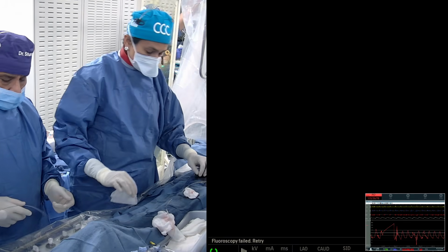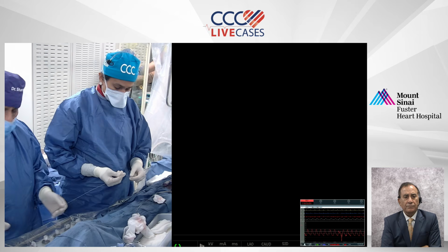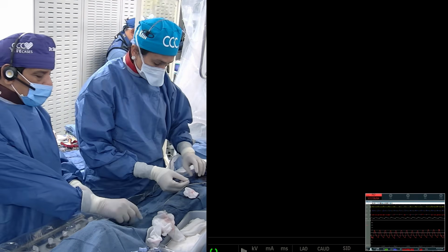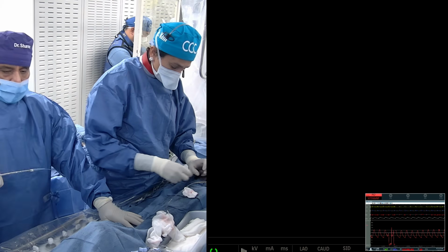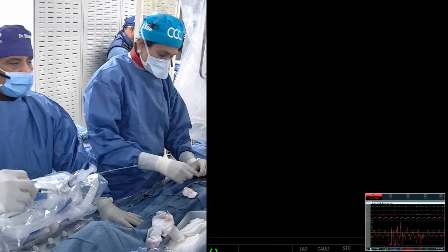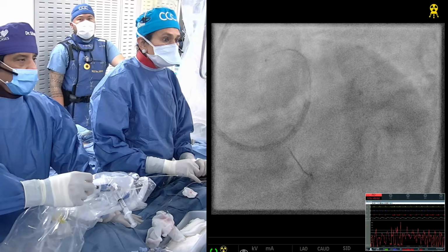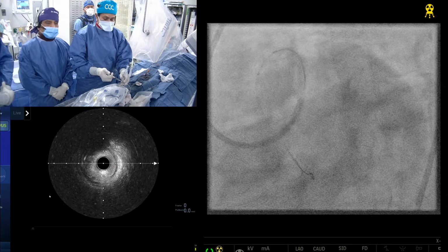Take the rotor wire question out. It had been asked, would you consider orbital? Yeah, this is a reasonable case for orbital. Yes, in aorto-ostial lesions, we have published that orbital is not good. All the people say that you manually advance into the vessel, start the crown, and then pull back, like retrograde orbital atherectomy, but we don't do it. So yes, aorto-ostial, no orbital. In non-aorto-ostial, like this case, orbital is completely fine. You take the rotor wire out.